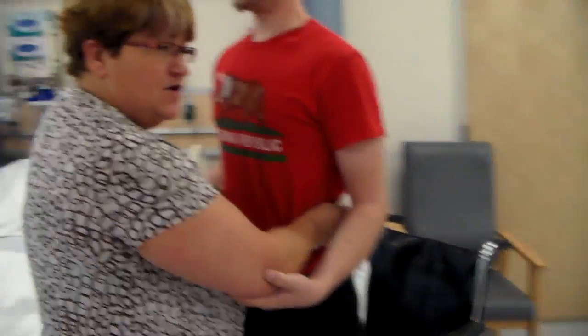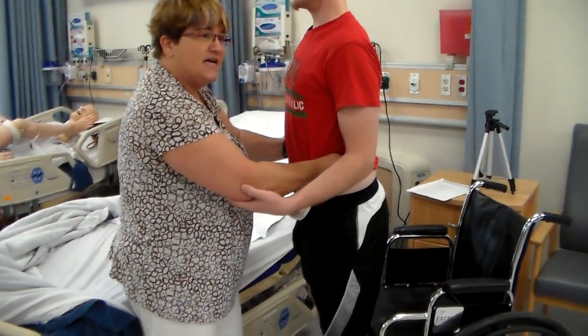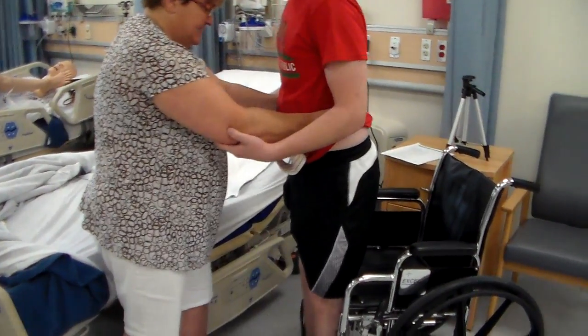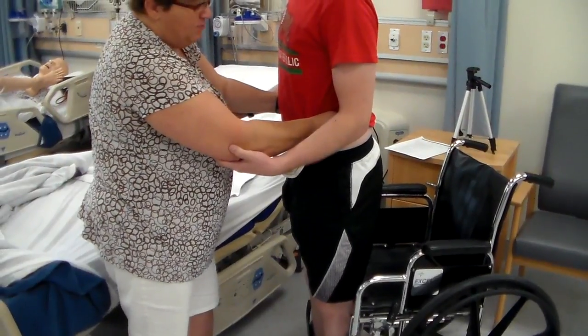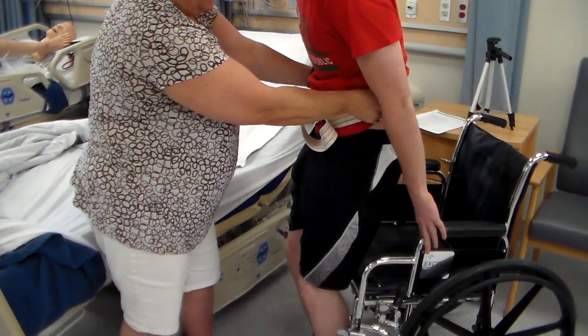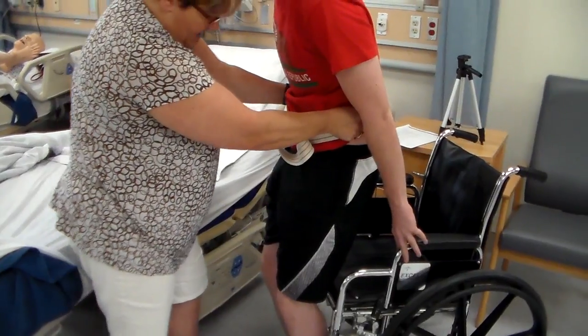Okay, now, when you get like this, you're going to have the patient back up until the back of their knees touch the seat. Okay, back right up. That's it. Now what I want you to do is I want you to take your hands and put them on the arms of the chair. Don't sit yet. There you go. Now he's got them there, so on the count of 3, we're going to lower into the chair. Are you ready? Yep.